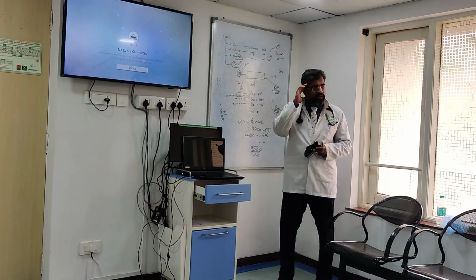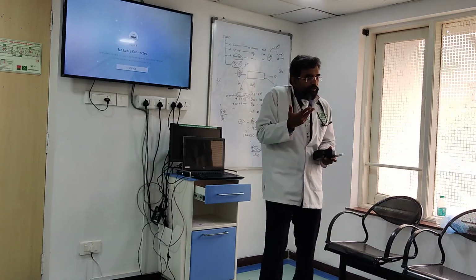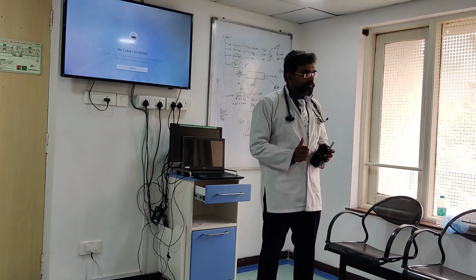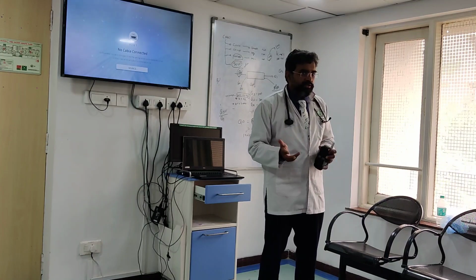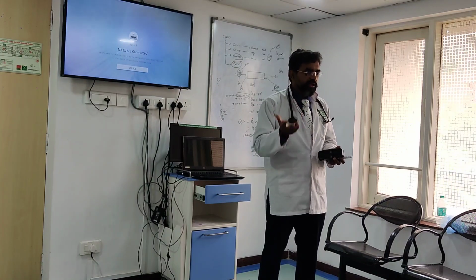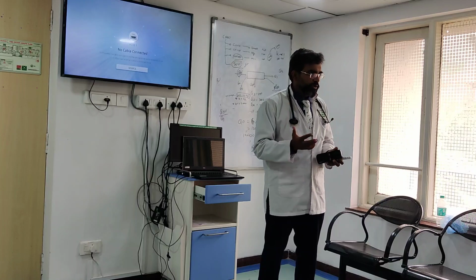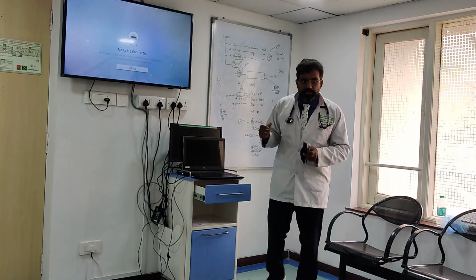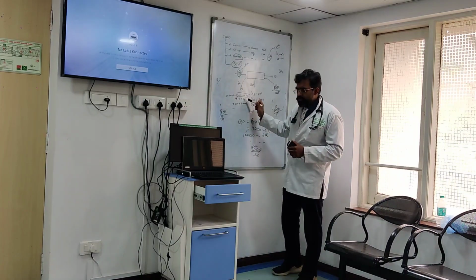Just thinking now. See, on an average you're thinking, after I do it, I will repeat after 4 hours. क्या होगा पोटेशियम को? 4 घंटे के बाद पोटेशियम देखो क्या हुआ, 6 घंटे के बाद, every 12 hours we'll keep repeating. Oh ऐसा हो गया, ठीक है अभी ऐसा हो गया. This is not the modality I want to use. At the same time, what I'm going to do in this case, I want to do it very fast.